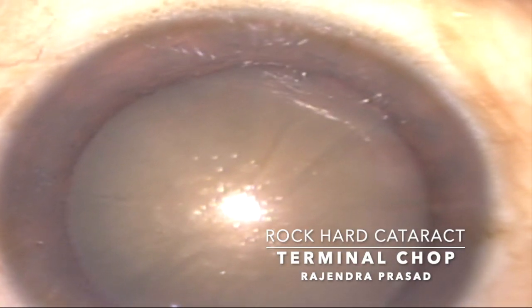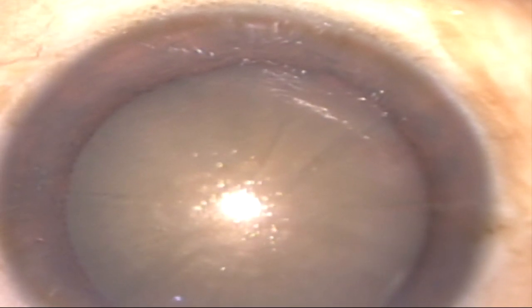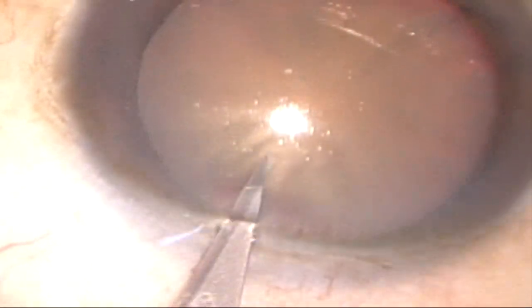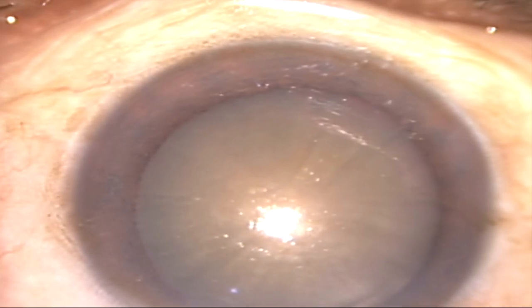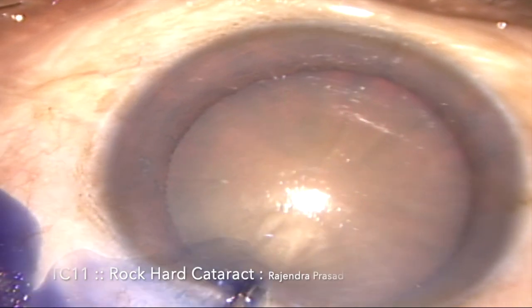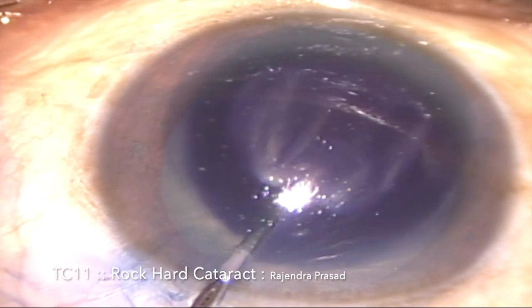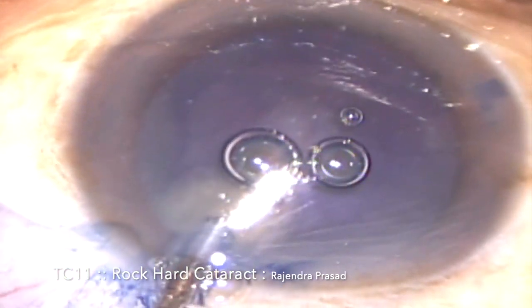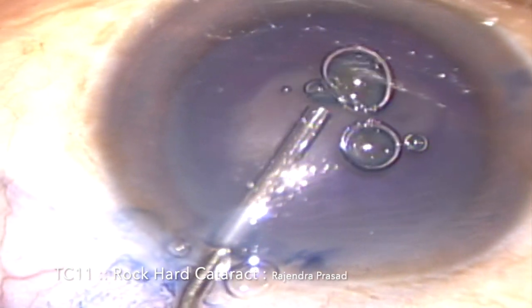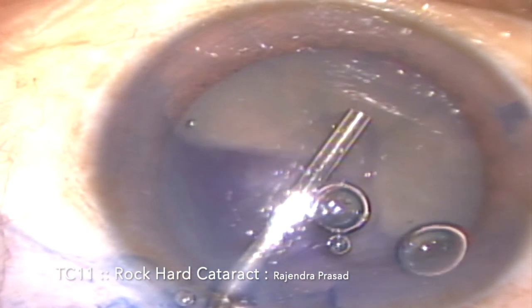Before we start capsular access, in this situation we have to stain the anterior capsule to enhance visibility. I've made a first side port incision and then I'm injecting 0.06% of trypan blue dye into the anterior chamber over the anterior capsule. Once the anterior capsule is stained, the remaining dye is evacuated out of the anterior chamber by injecting dispersive OVD.